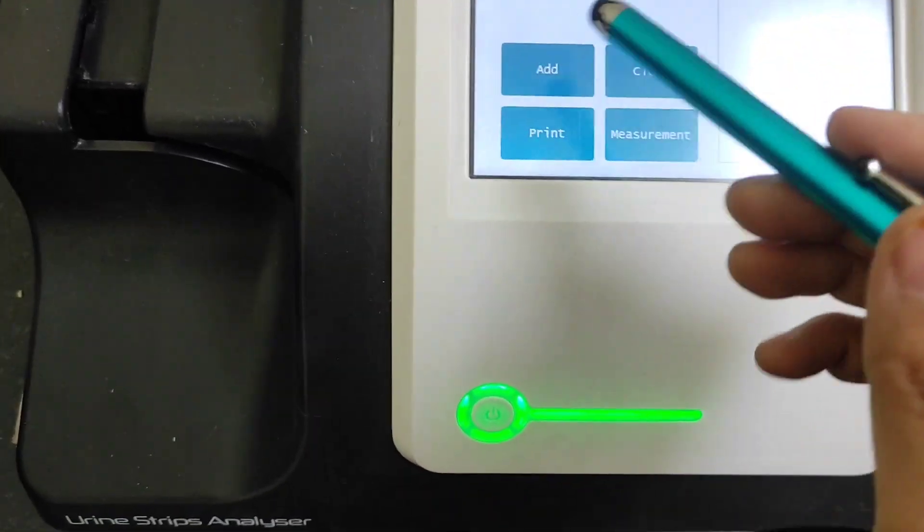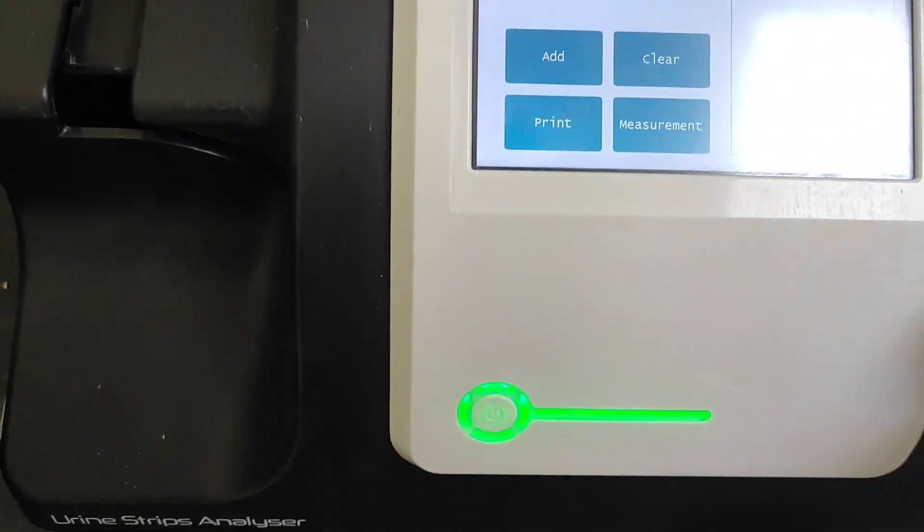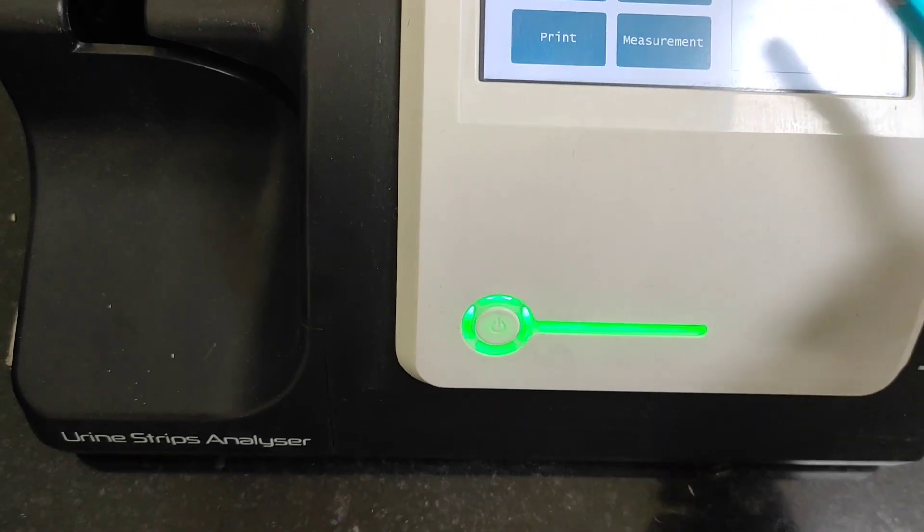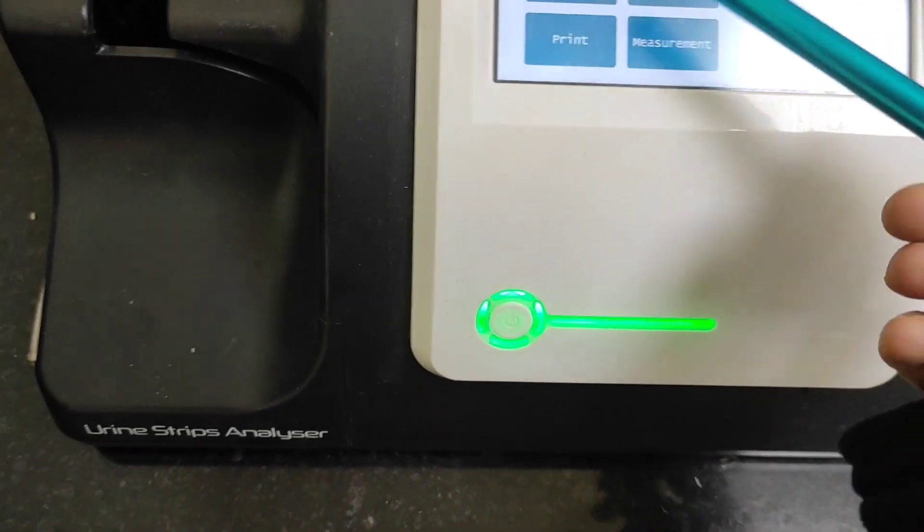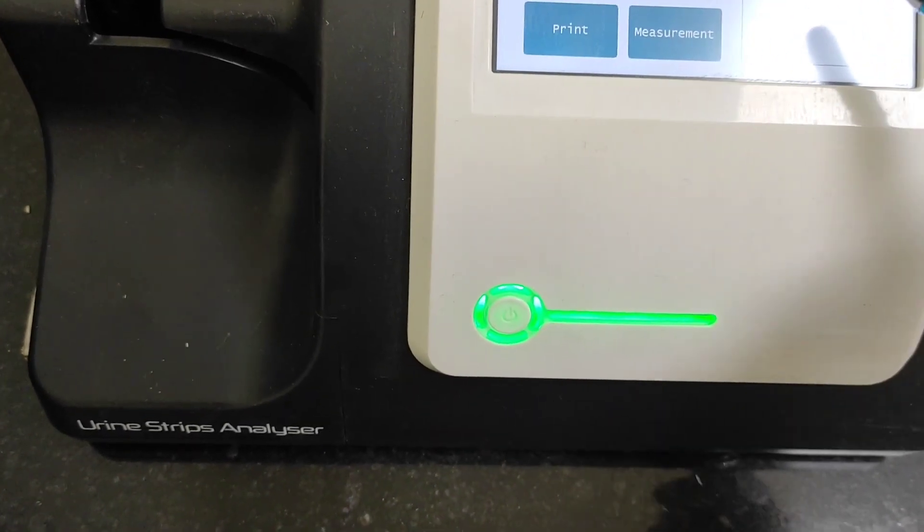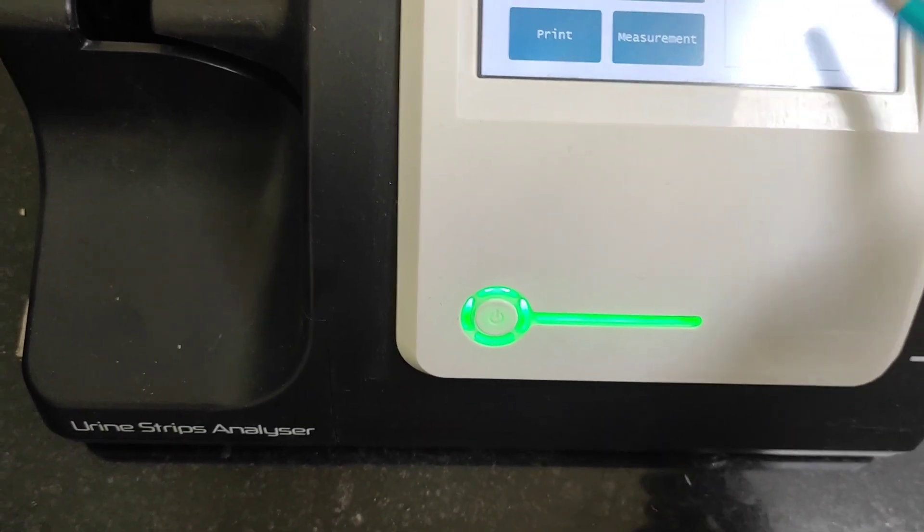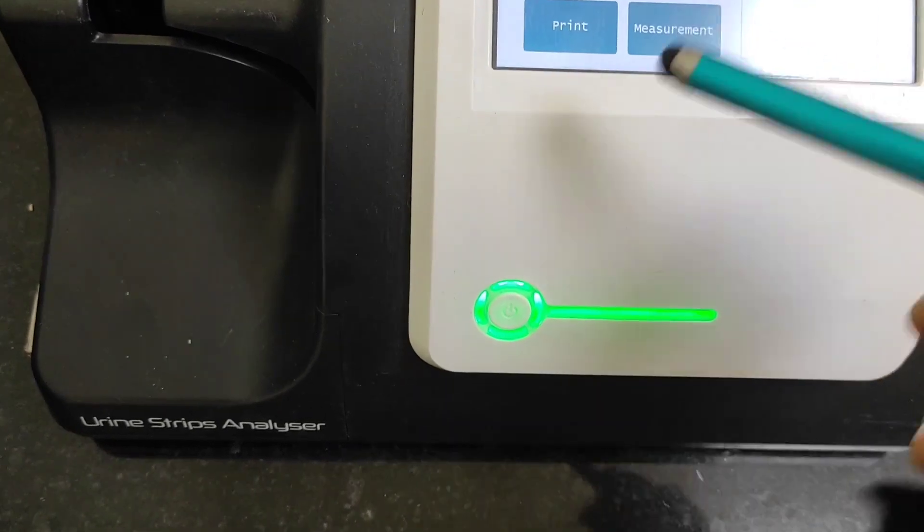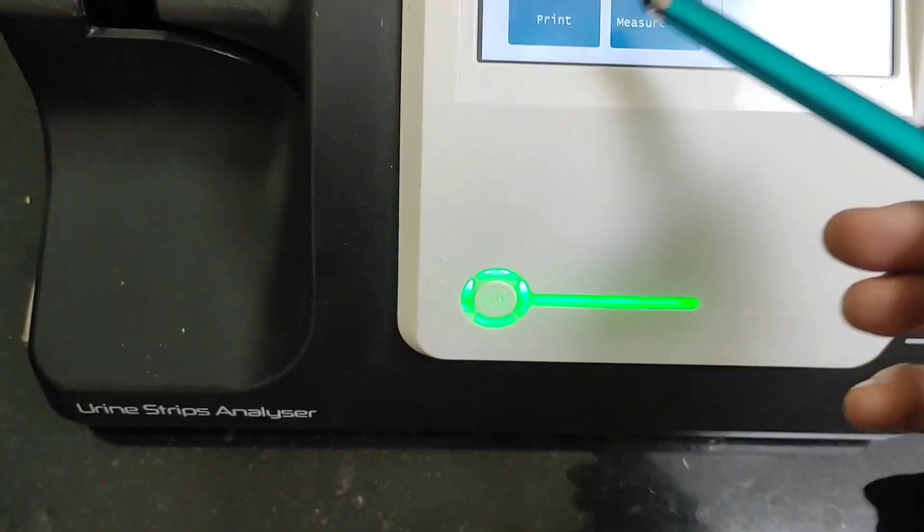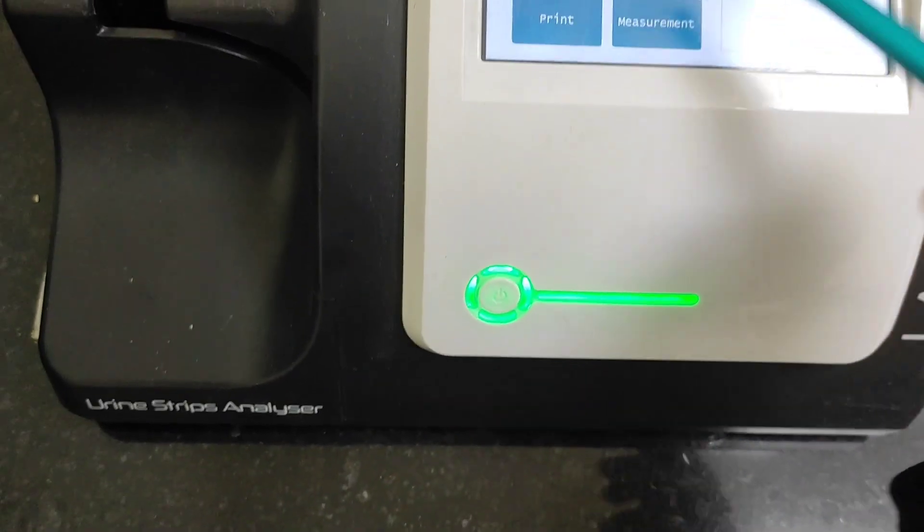As you can see, work list, whatever work you have done or you are going to add some patients name, or if you have to clear something, you can clear it from here.